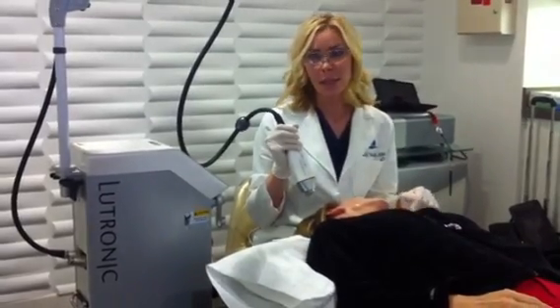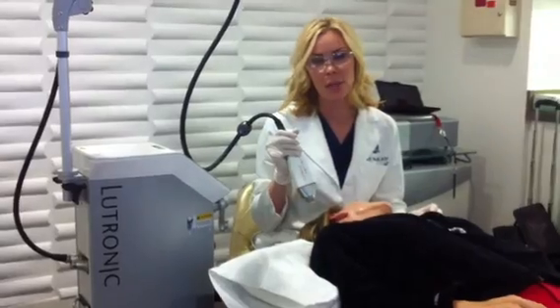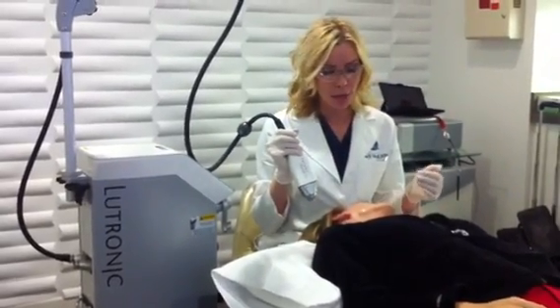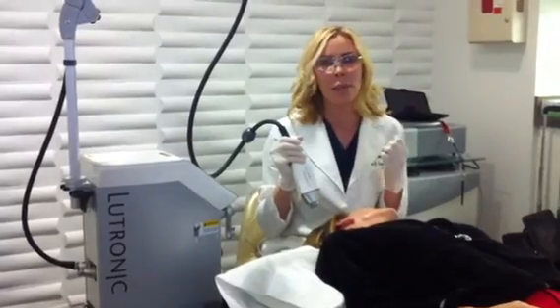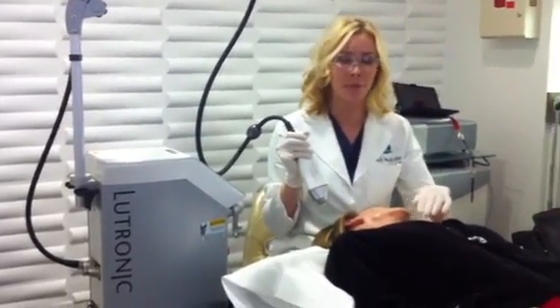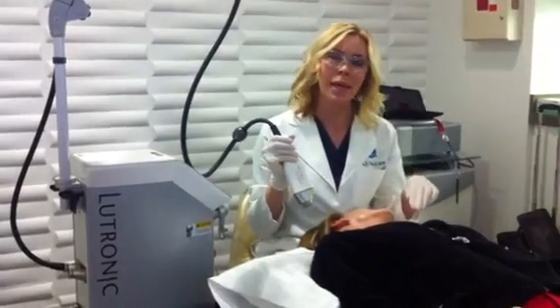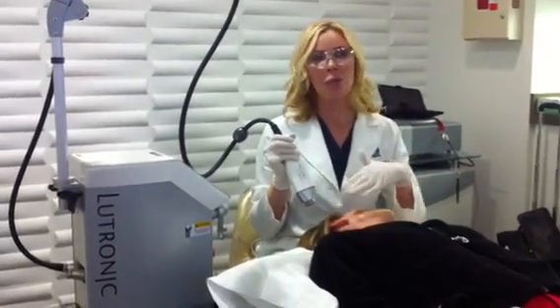This is done as a series of treatments, and it's usually done about every 2 to 4 weeks. I usually do it monthly on patients. And so this is a patient we've done some really nice procedures on and have helped to rejuvenate the neck, but I want to get after some of that crepiness. So we do this in a couple passes. I've done one pass with the deepest setting on the left side of her neck, and I'm now going to demonstrate it with this deep setting on the right side of her neck.